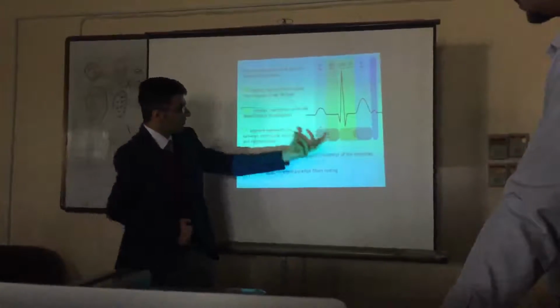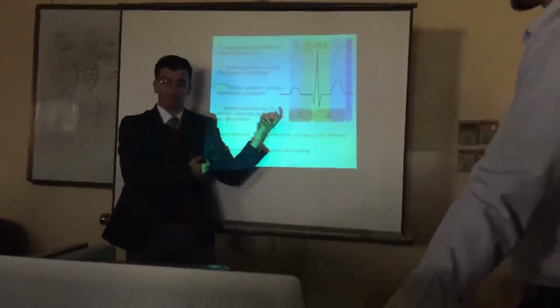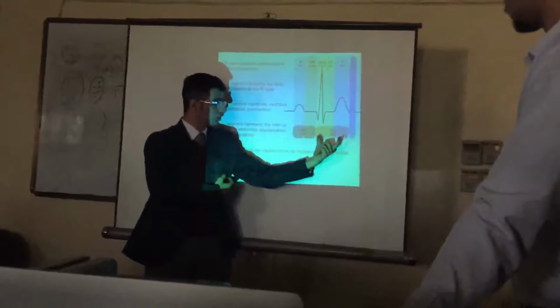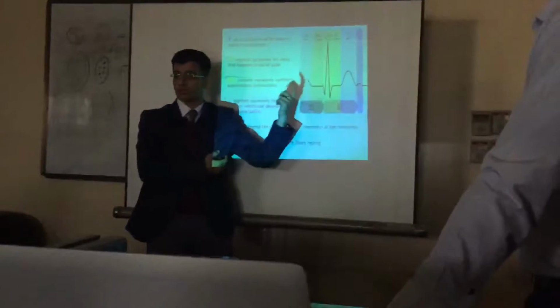Then we have two important intervals: the PR, the contraction of the atria, and the QT, the depolarization, the contraction and relaxation of the ventricles.